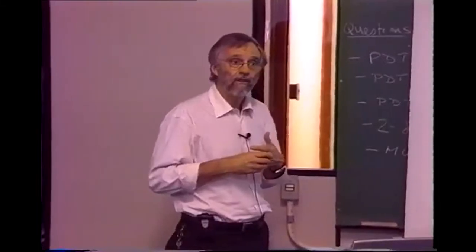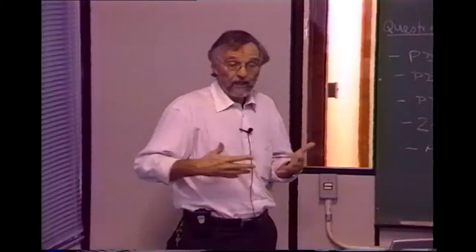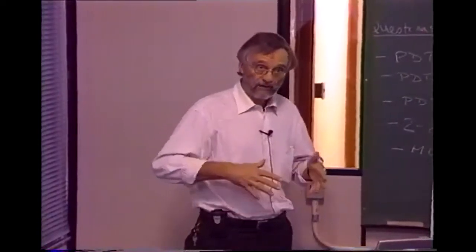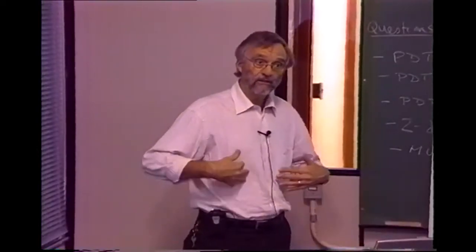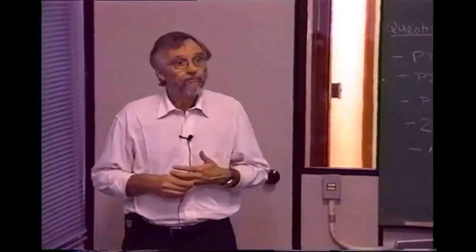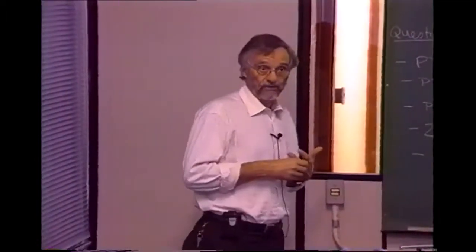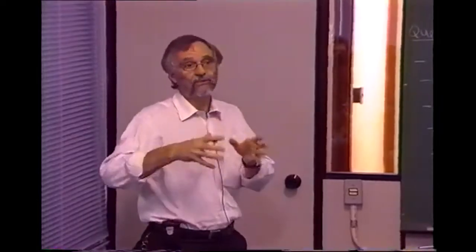What about other organs? Well, the idea is that you treat the whole of the surface of the abdomen, the whole of the intestinal tract, the whole of the peritoneal bed, all surfaces. But do we have any really good cases? There are individual cases that are very good, but the whole process seems to be very difficult to reproduce.